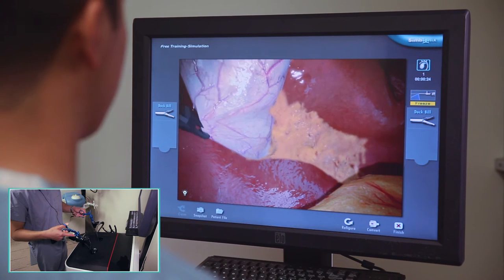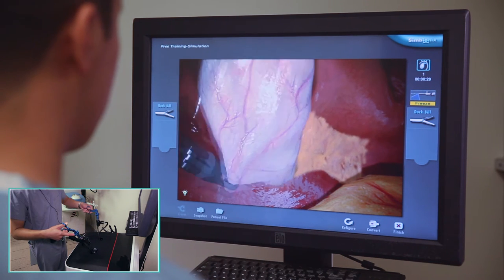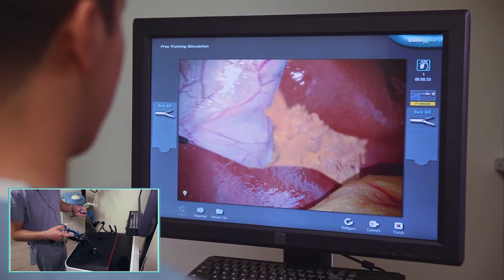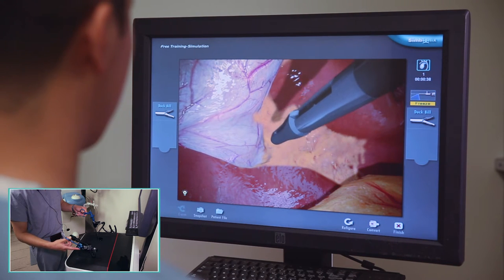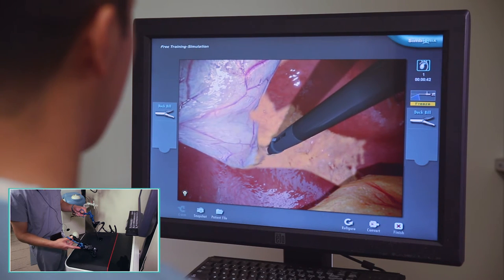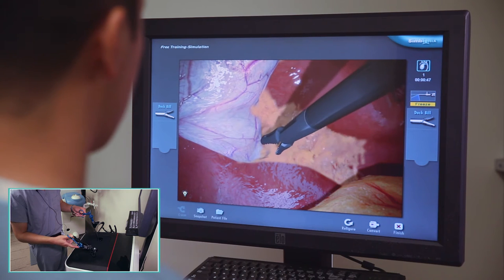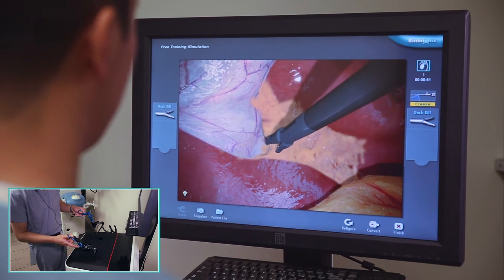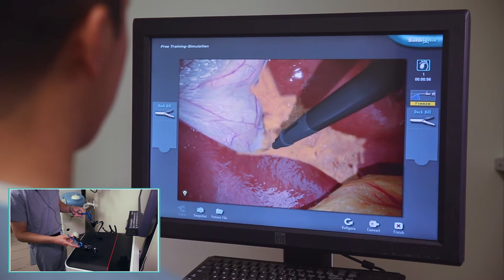Otherwise, if you don't retract this properly, you're going to make your life much more difficult. I'm going to pull the gallbladder towards me by pulling and also pushing my hand a little bit forward to give myself good exposure. I'm going to start my dissection at the neck of the gallbladder and proceed downwards. The neck of the gallbladder is the safest part to start your dissection because you're proceeding from what is known — that the gallbladder is going to eventually lead to the cystic duct — towards the unknown, all the stuff down here which is not well defined at this point.